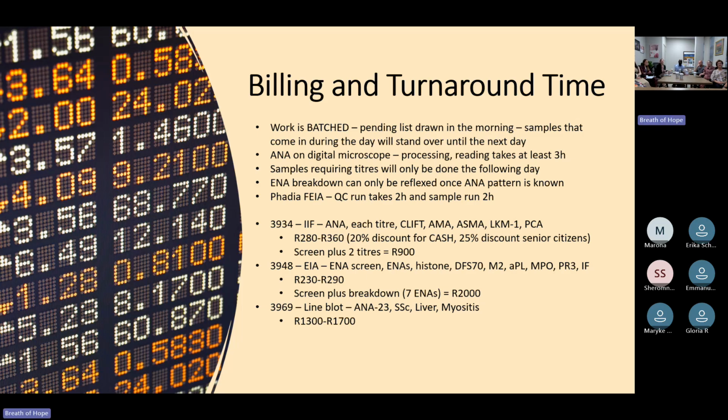Okay. All right. So an issue first, about the practical aspects of this testing, is that the test is batched. So that means that it takes quite long for these things to run. It's not a sort of random access. You're not going to quickly load it and then in half an hour there's a result. It doesn't work like that.